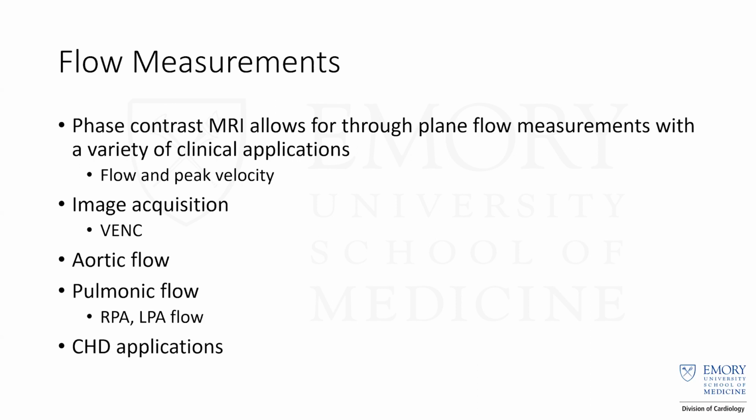Certainly, if you're looking for different types of shunts, and you're looking for whether patients have certain stenoses in branch pulmonary arteries, or you'd expect different flow patterns between your RV and your LV, this can help you figure out those differences.